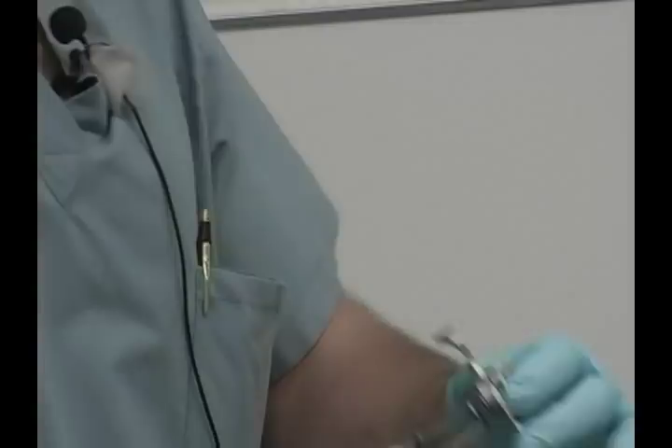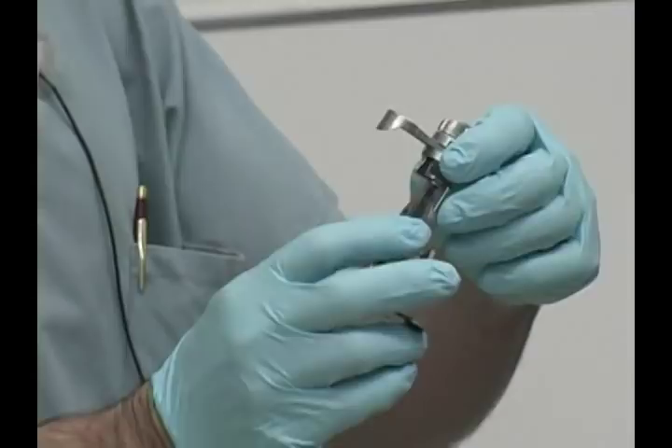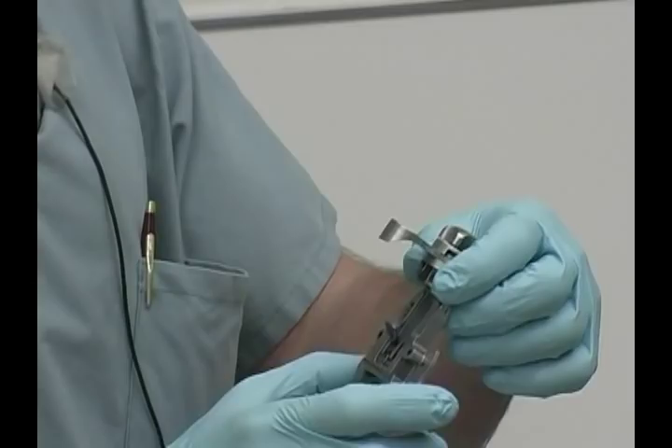Another nice feature of the high performance instruments is the sizing guide for the femur. The fixed femoral sizer is very simple to use — low profile for small incisions and much simpler and cleaner than the older instruments.